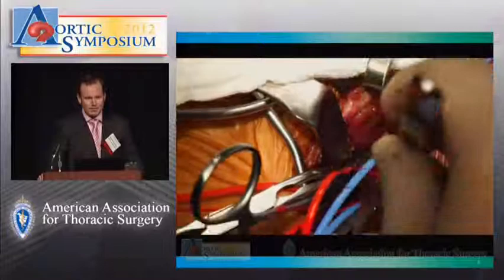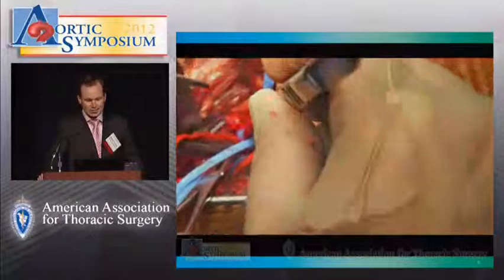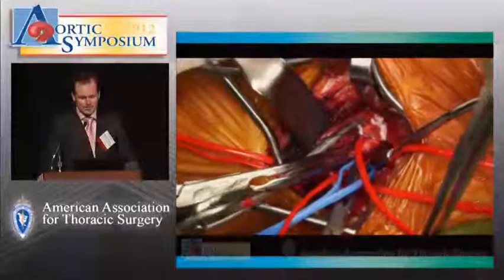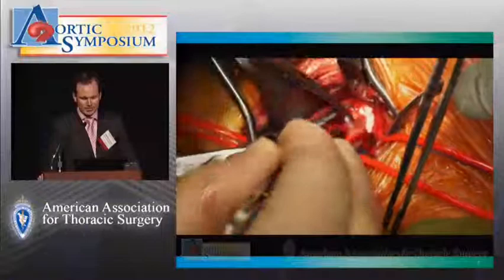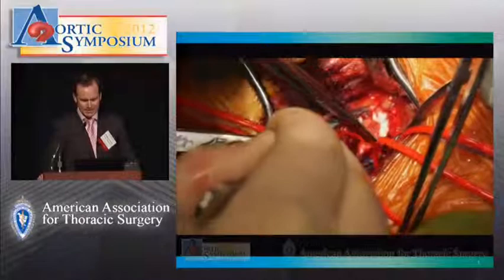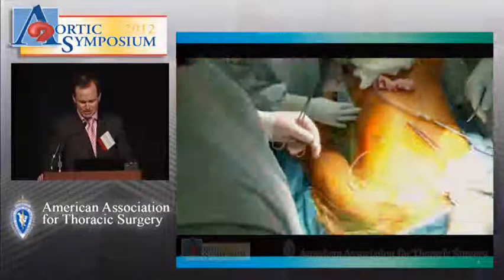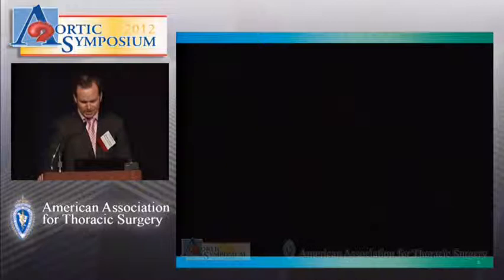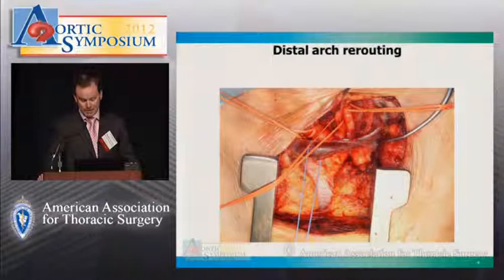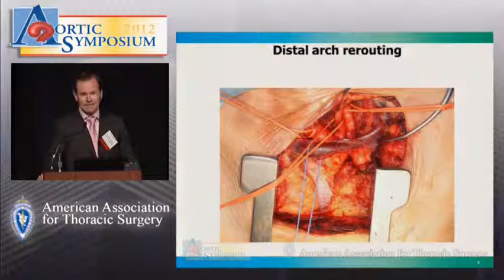A clamp is applied proximally, then the vessel is partly dissected in order to have enough control for the proximal stump. We do a double oversewing as well as reinforcement with Teflon pledgets. After having secured the stump, we completely transect the vessel — because if you don't have sufficient proximal bleeding control in the subclavian stump, you can get into trouble. Then a classical transposition between both vessels is performed, thereby maintaining supraortic perfusion, not only for the posterior cerebellar circulation, but especially for spinal cord perfusion.